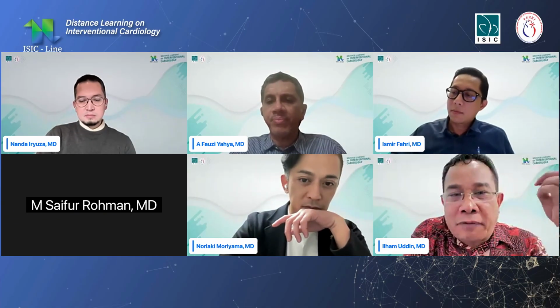Okay, how about Dr. Ilham? Would you do anything differently? It is almost the same, I think. But there is a concern about the stent expansion, because not every center has a good stent. When we do left main PCI, we need a bigger stent, so we need to think about using an NC balloon, short stent balloon, as we need the size to match precisely with the left main size.